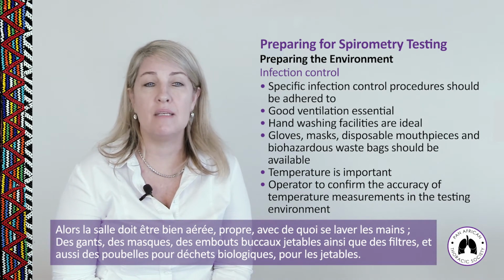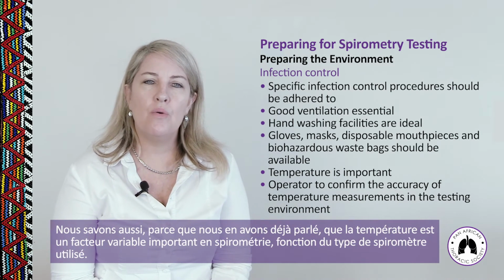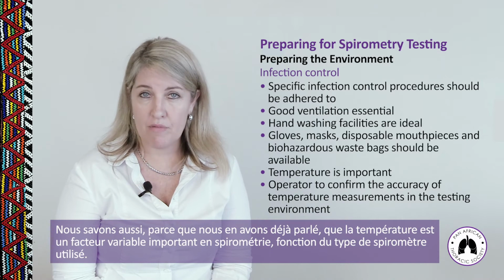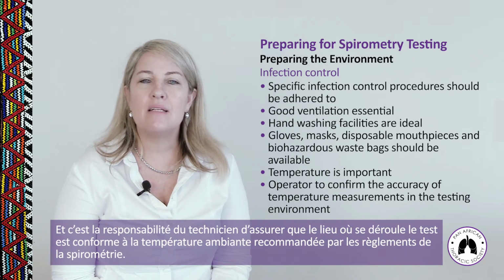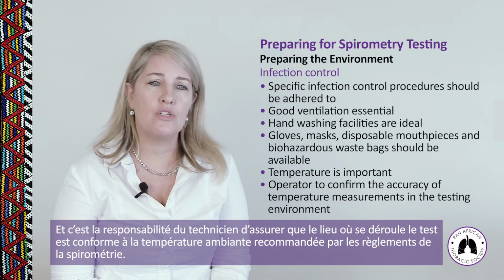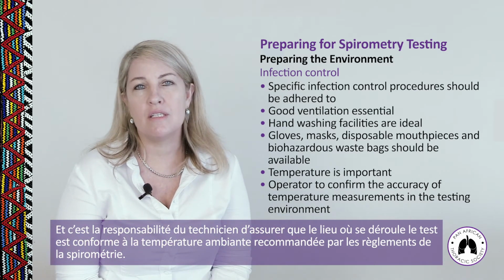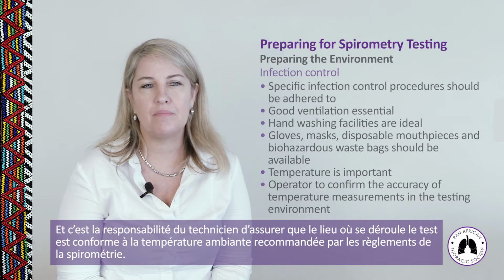So we also know, as we've already discussed, that temperature is an important variable in spirometry, depending on the type of spirometer used, and that it's the responsibility of the technician to ensure that the testing environment is within the ambient conditions allowed at the time of testing.